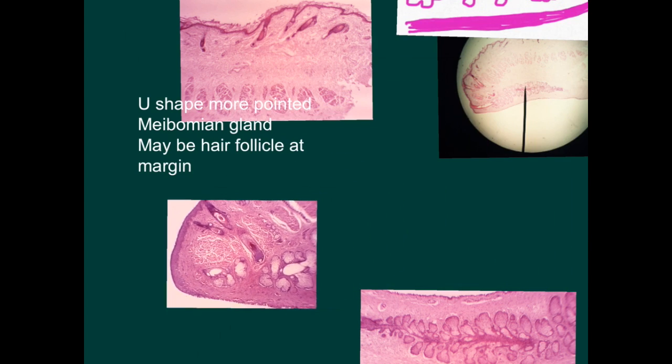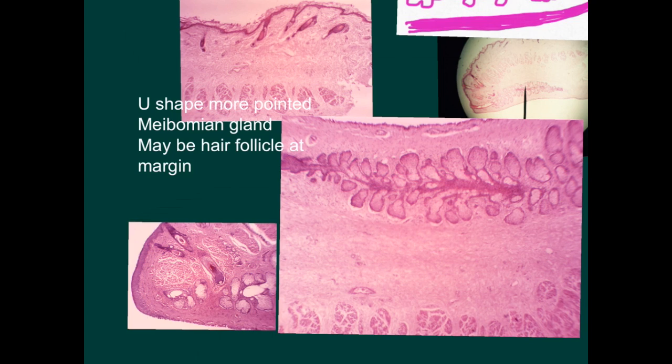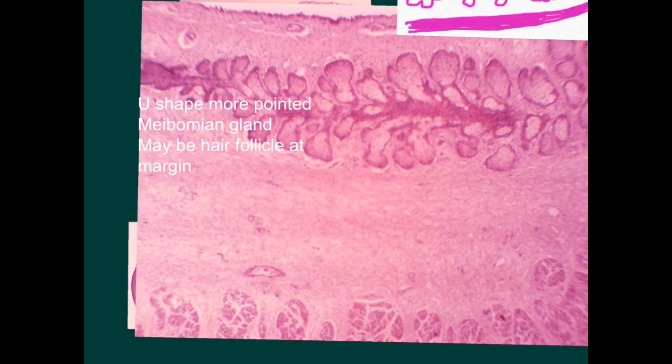Again, we have another picture also. This one demonstrates very nice meibomian glands towards the mucous membrane side, and they are vacuolated. If you look carefully, you will notice that these cells towards the base have nuclei and not nucleated towards the center. I'm trying to differentiate between these glands and the mucous labial glands in the lip, because it is a very important clue to differentiate between them. Also, the muscle here is almost in one direction, but in the lip they are in different directions.